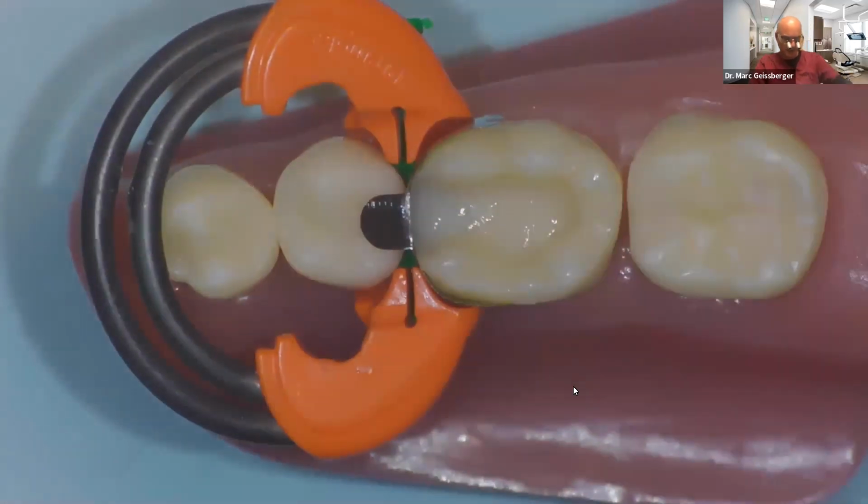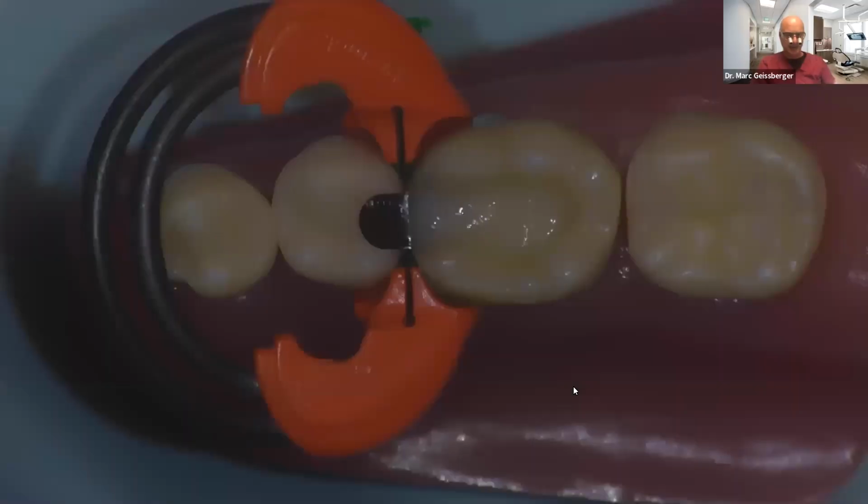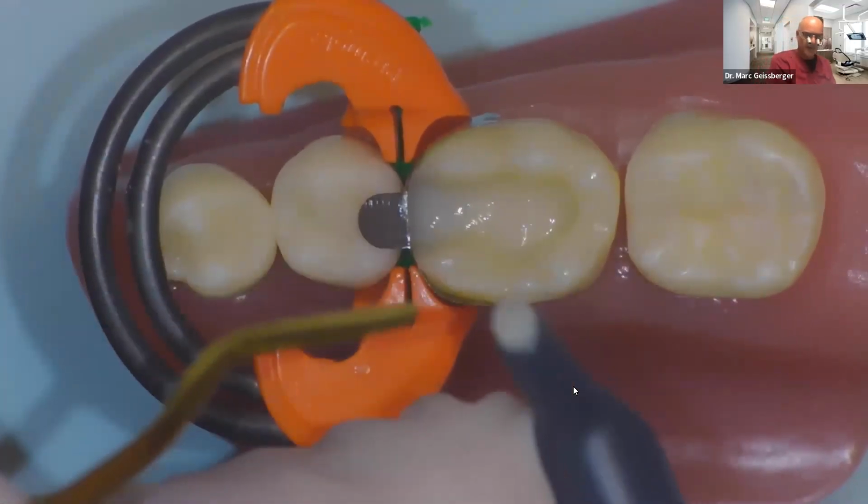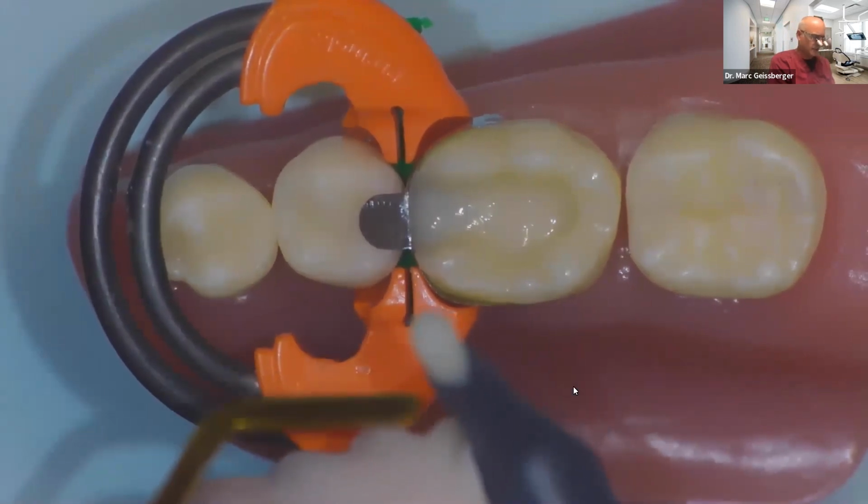While she's shining with a light, I'm cutting off the next composite that I'll place. I'm going to cure for 10 seconds and then cut off that composite. Okay, so you can put a clock on it, and you'll see that I really don't spend an extraordinary amount of time in placing the next layer because I'm incrementally layering this. I'm going to cut off my composite. So I express that composite.